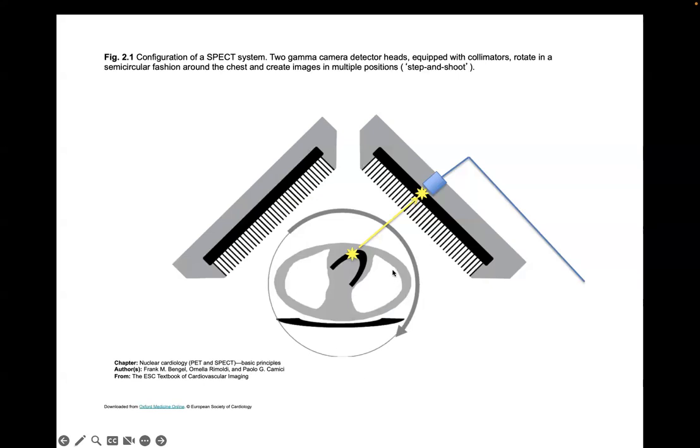And so if I have an event over here, but the photon comes this way, you want to stop that photon, because you don't want to have an excitation occur here. The detector records an event over here, and it will assume that event came from somewhere along this line in the patient, which is wrong. So that's why this collimator is in place: to keep the detection limited to those events that occur with a straight line projection down through the patient.